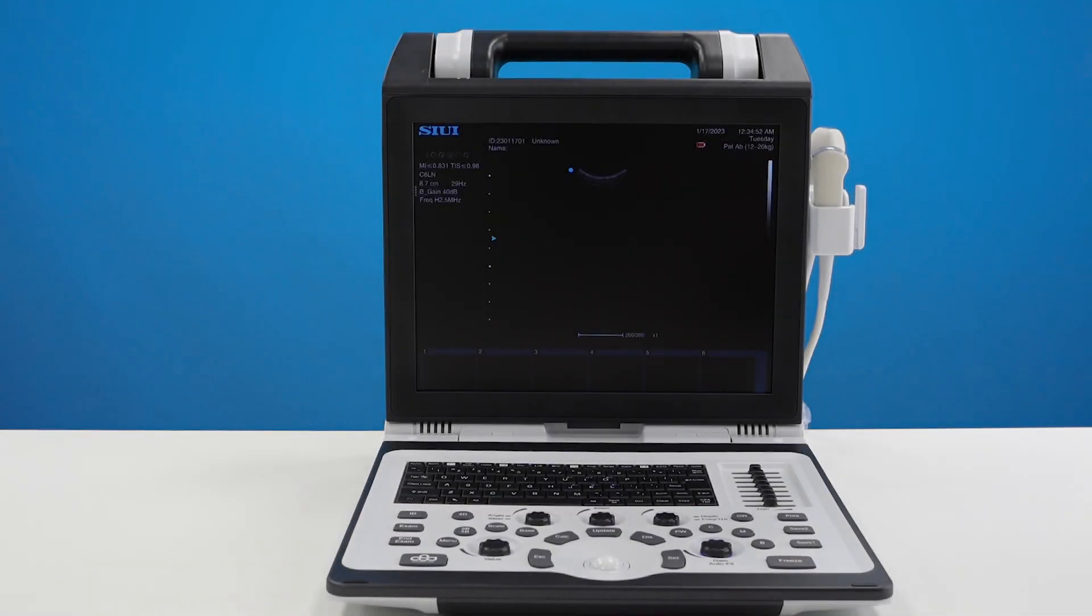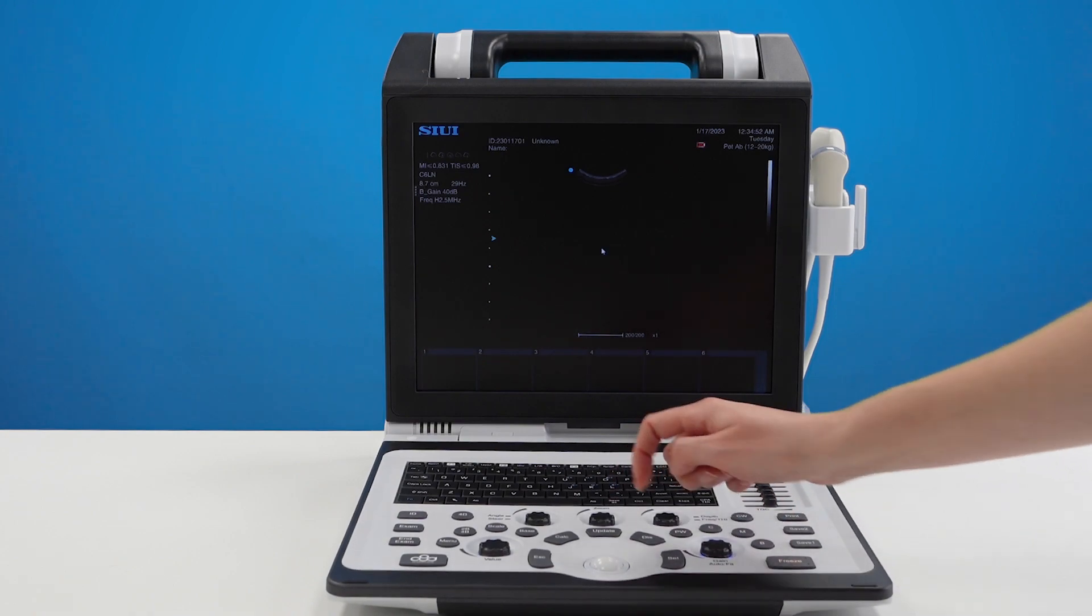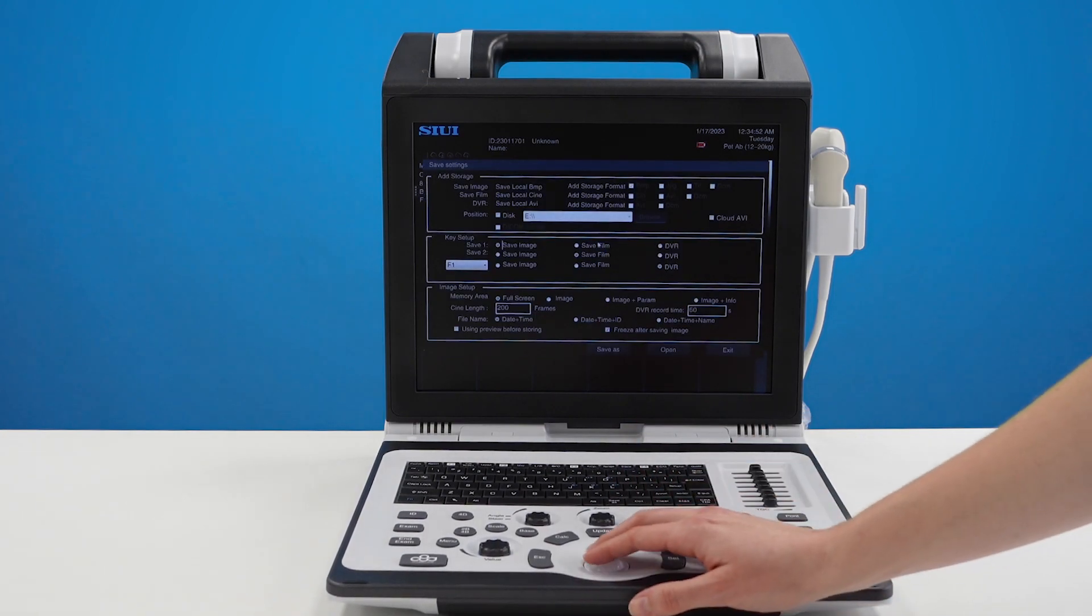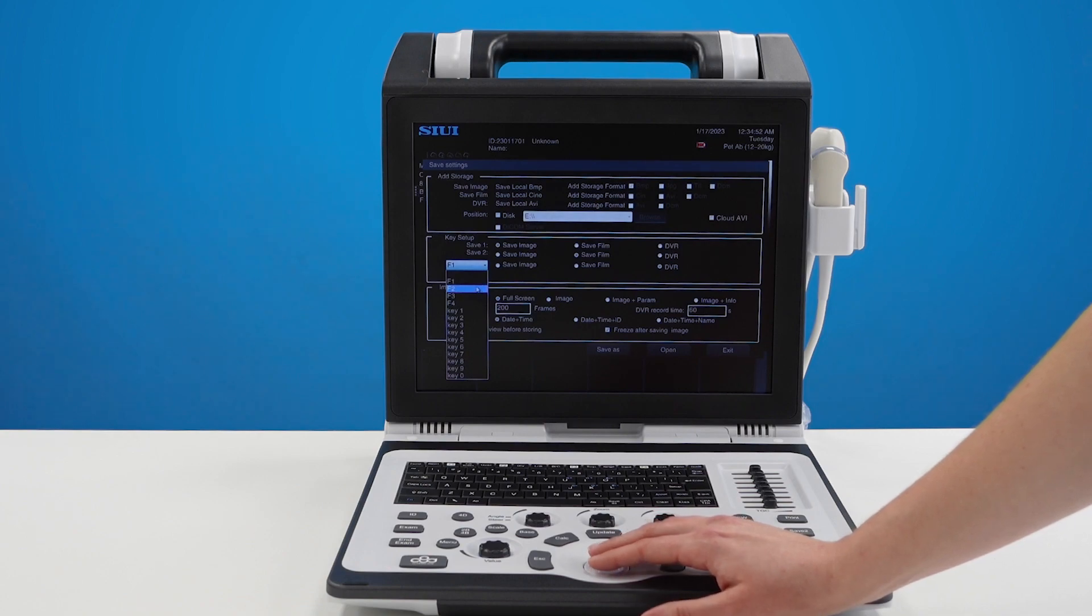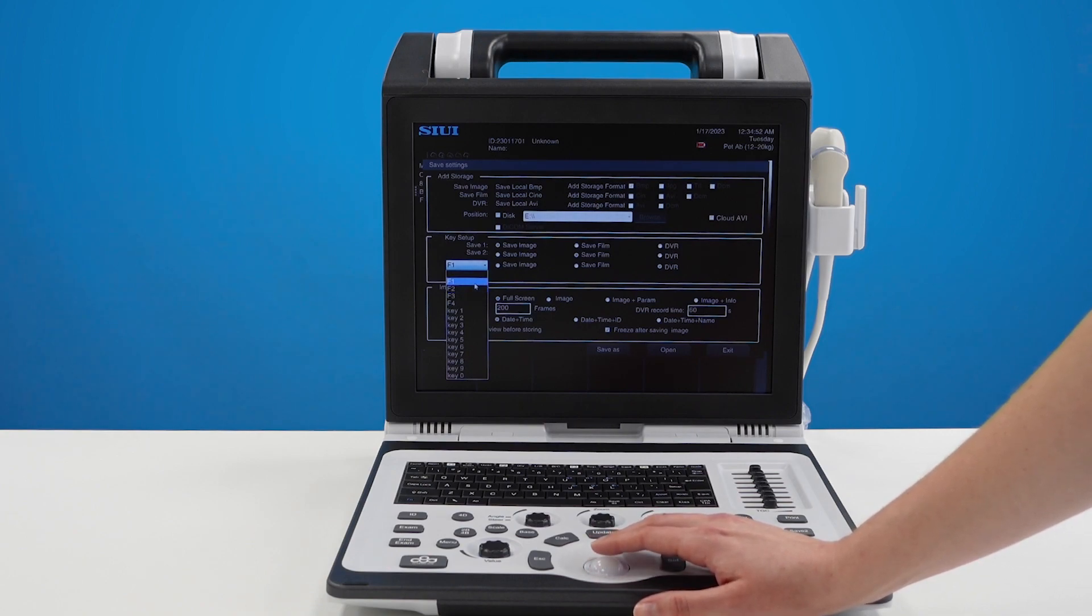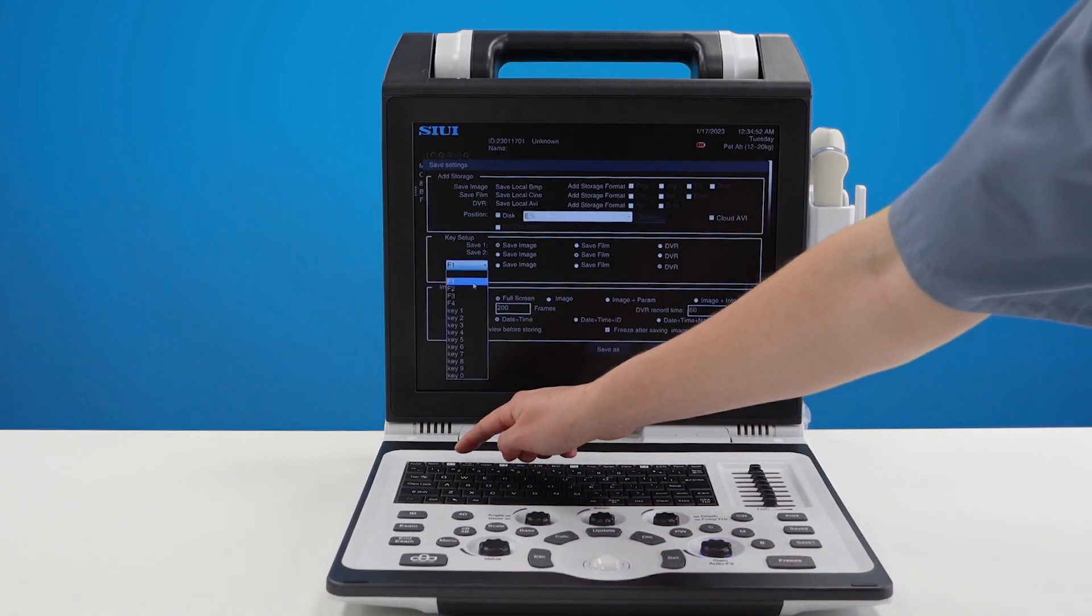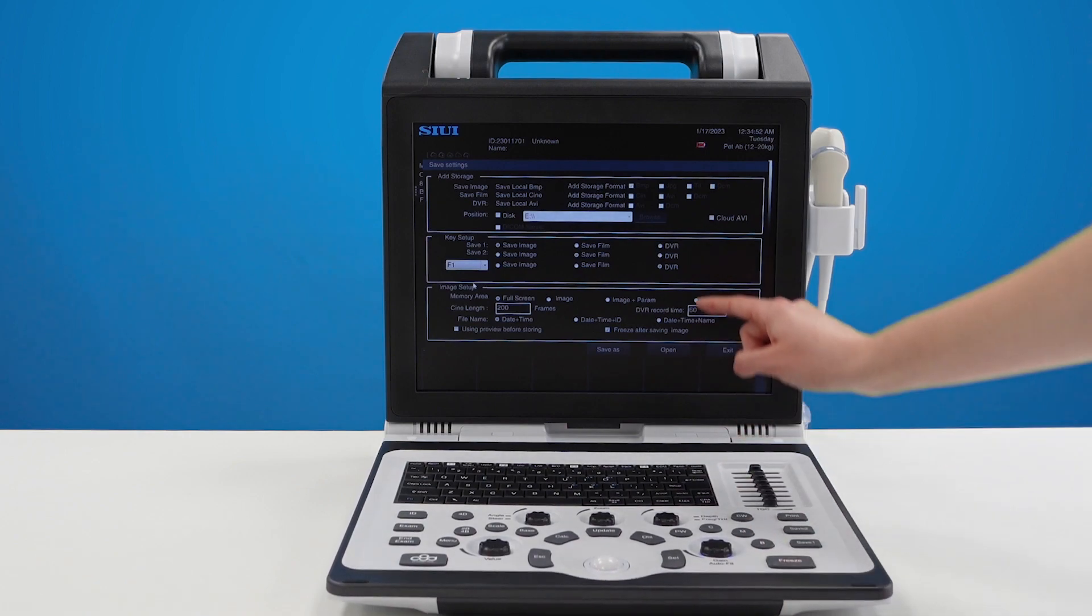If you're going to be recording long video clips for teaching or video cases there's one other thing you'll want to do. Press the save as button and in this drop down here select what you would like your hotkey to be for recording long video clips. I like F1 just because it's nice and easy up here so I've selected F1.